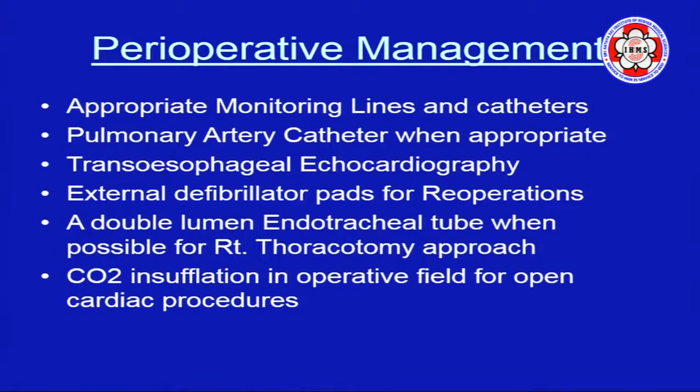The perioperative management and appropriate monitoring lines are typical for any cardiac surgery patient. Pulmonary artery catheter, when appropriate, meaning when you have low cardiac output, pulmonary hypertension, or multi-valve surgery, I always put in a pulmonary artery catheter.